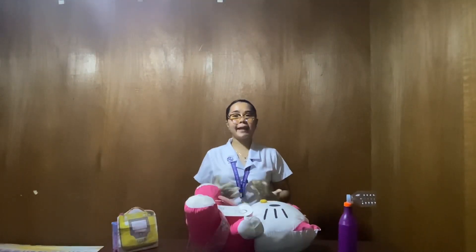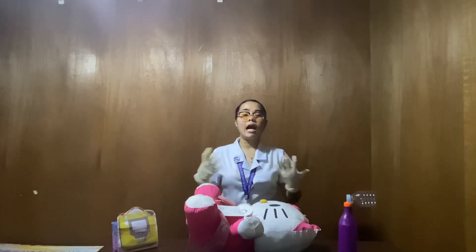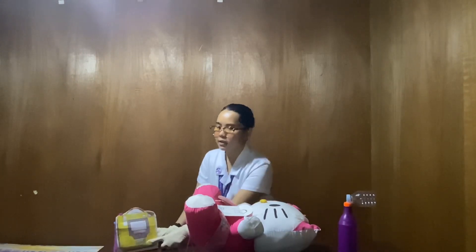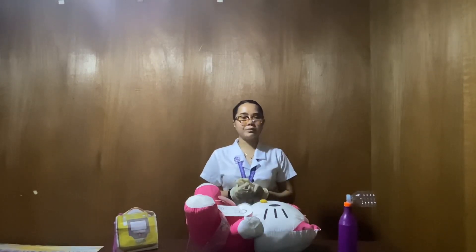After a while, the AED may tell us to stay away from and not touch the patient because it will deliver an electric shock. When that happens, we safely deliver a shock: 3, 2, 1 — shock delivered. Next is to switch roles every 2 minutes or after every 5 cycles and then practice good team dynamics. That will be all for my return demonstration of adult cardiopulmonary resuscitation.